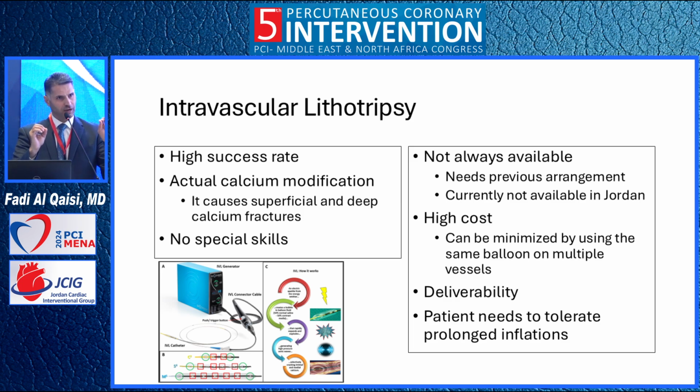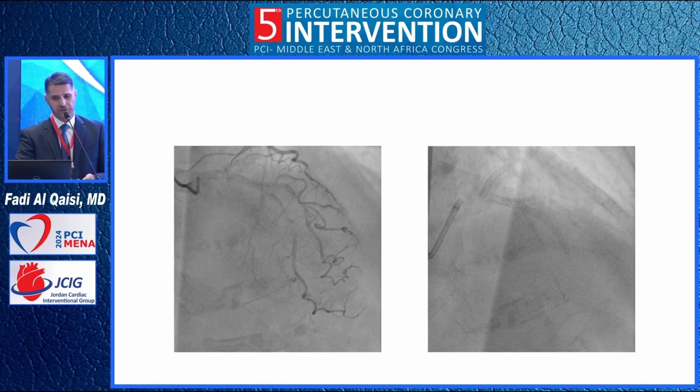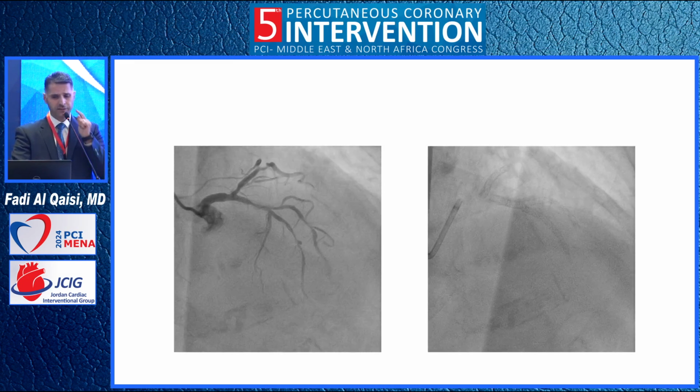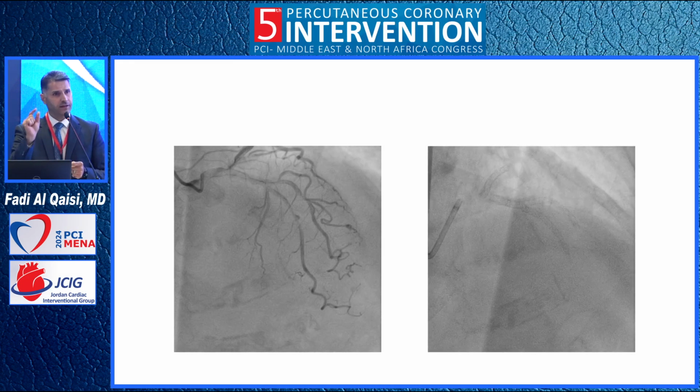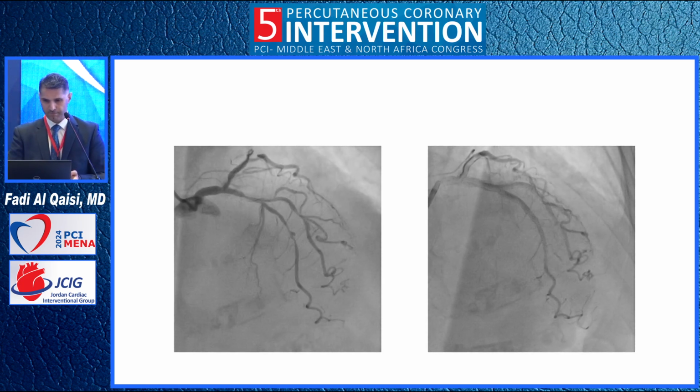It has deliverability issues. You have to have preparation of the artery to deliver the balloon. And the patient needs to tolerate long inflations. Otherwise, there are going to be some problems with ischemia. This is a case for which I used lithotripsy in Jordan, and I did a nice bifurcation. I used the same balloon on multiple arteries, so I can save the cost of one balloon.